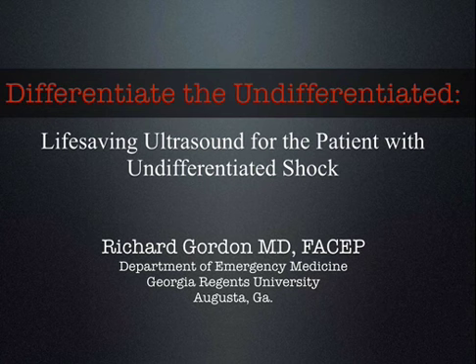Now, will you be able to walk out of here and do this algorithm as I'm going to present it to you today? Probably not. You need to get your hands on the ultrasound machine, but this is to inspire you, to get you to start thinking about using this. If you are coming on shift or maybe going off shift and your partner has one of these cases, drag the ultrasound machine in there while you've got a little bit of time to do some scanning and you're not having to actually do the medical care. With a little bit of practice, you can do this. You do not have to be an ultrasound super user to do this, all right?